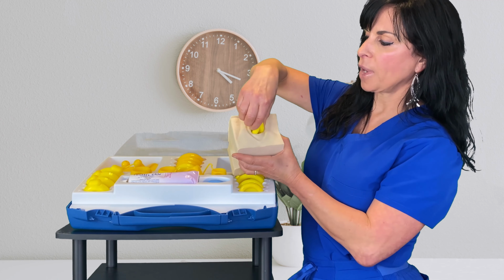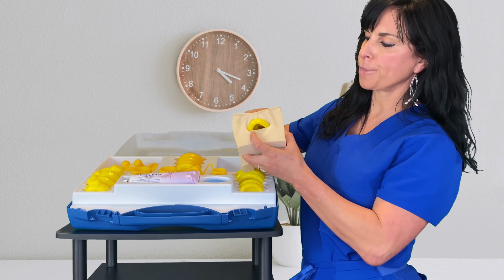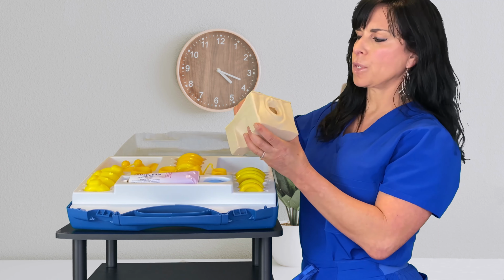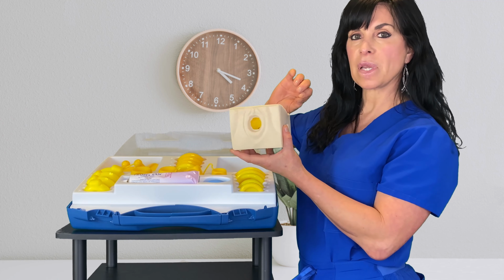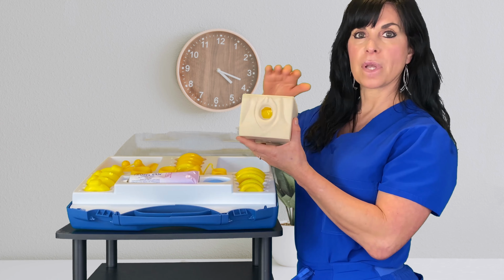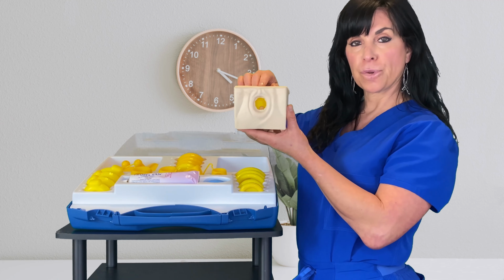And when you get it past the opening to the vagina, once it's past that opening, it's going to actually pop open inside. And there's no adjustments that you need to do. It just needs to be behind the urethra, which is your pee tube. So the opening there, you're going to see when you look in a mirror, make sure that it's not occluding it or obstructing it so that you can't pee. And so it's pretty easy, believe it or not, to insert.